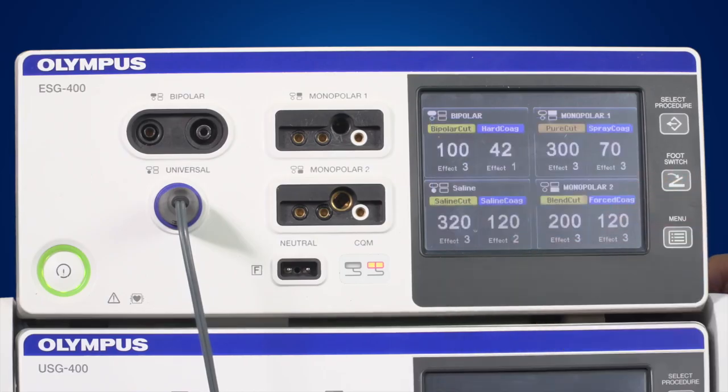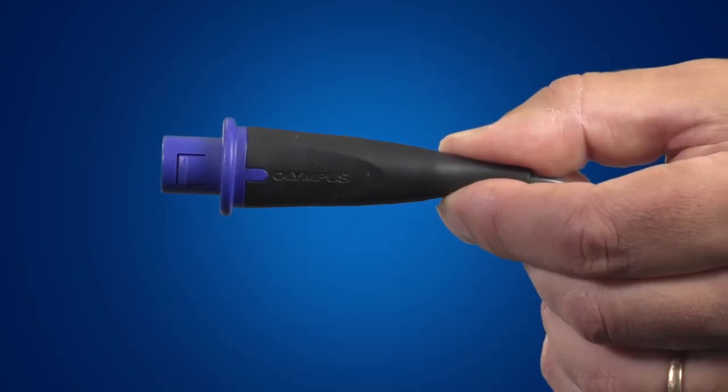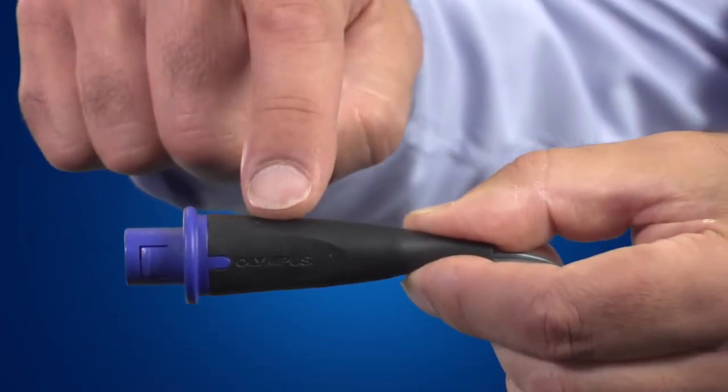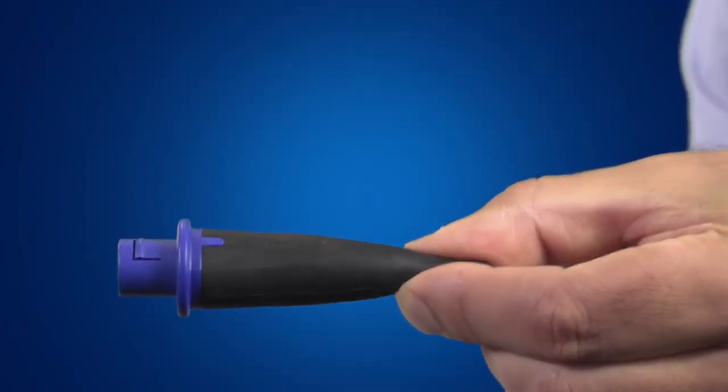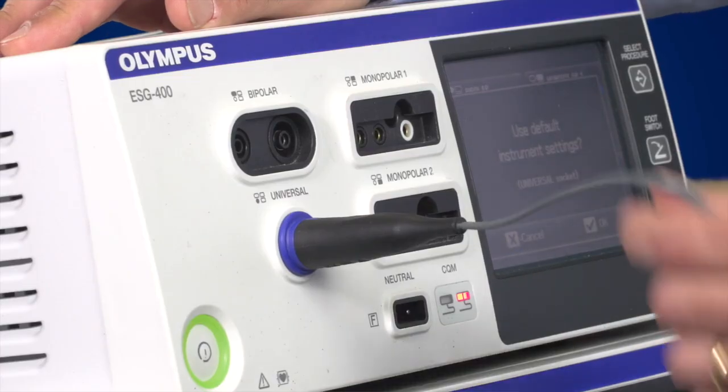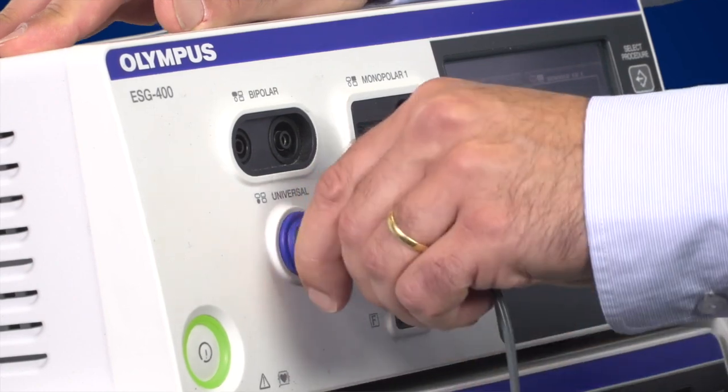Or make use of pre-selected saved settings. When connecting the universal plug to the ESG400, the Olympus sign should be pointing upwards. When removing the cable, do not pull on it — instead, pull on the plug itself.